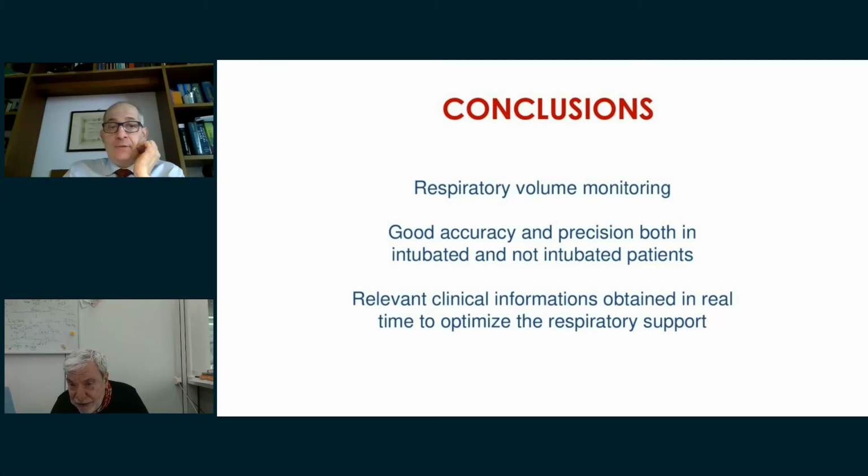Davide, can you also say how to measure this for patients on nasal cannula? Yeah, in the same way as Professor Gattinoni told us. We can put in an esophageal balloon, or we can have some idea by putting a probe into the nose during nasal cannula, in the other part of the nose, and you can see a change in pressure. There are just one or two works; it seems related to the inspiratory effort, but it's not the same, it's related.